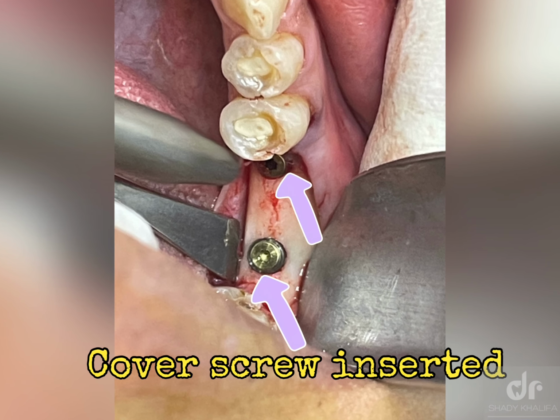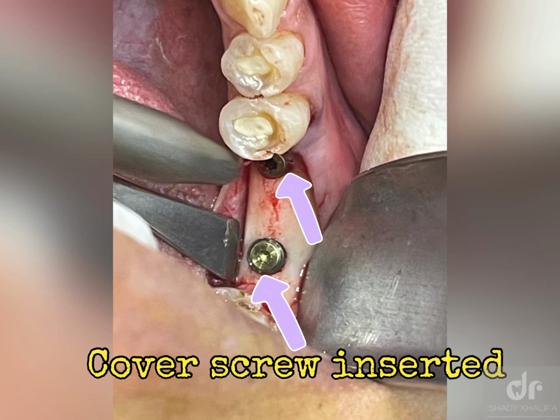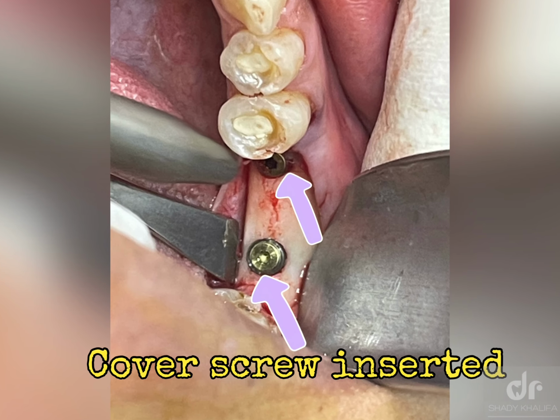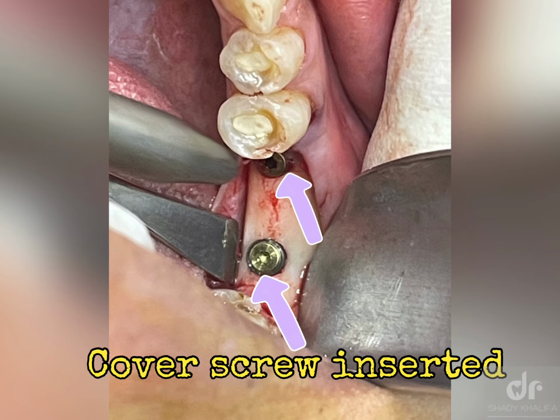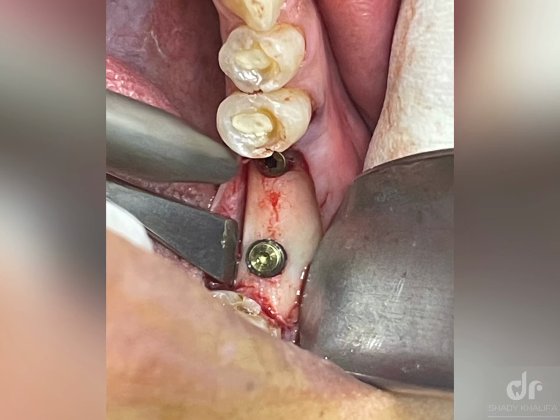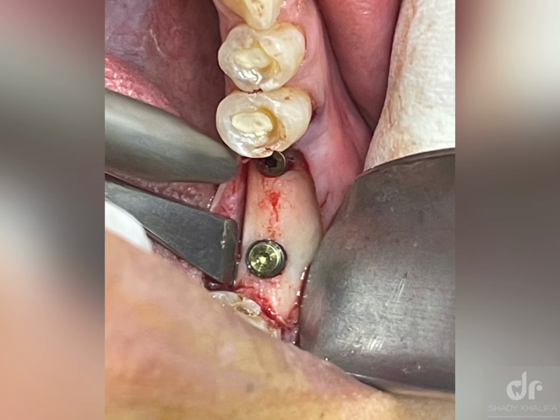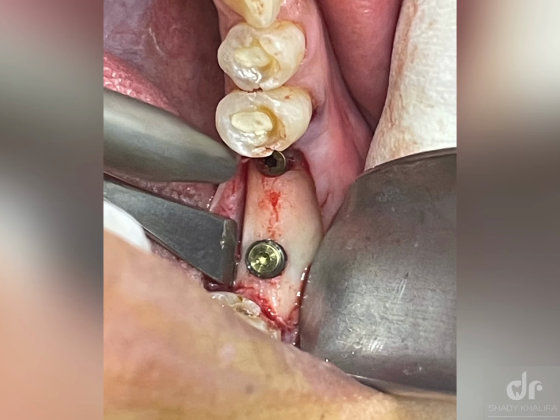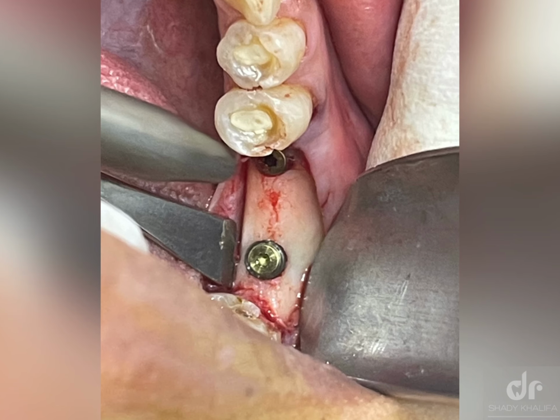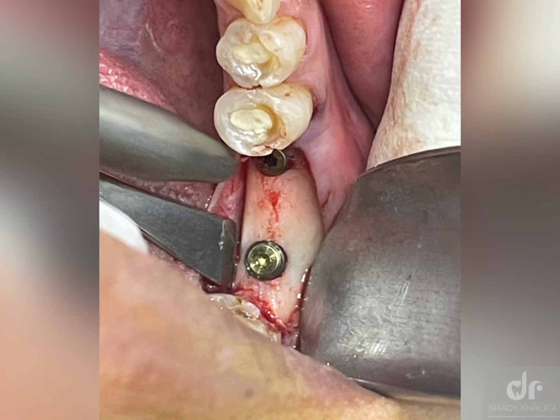And finally, after the implant has been inserted, we put the cover screw here. We notice the direction and the buccal and lingual plate. Actually, as I said, the ridge is a little bit curved, so the photograph maybe is not that clear for both of them.